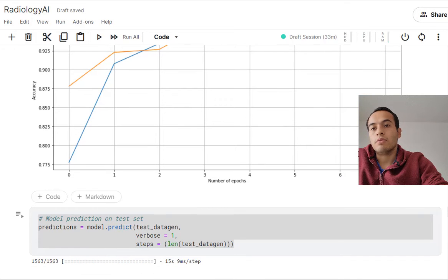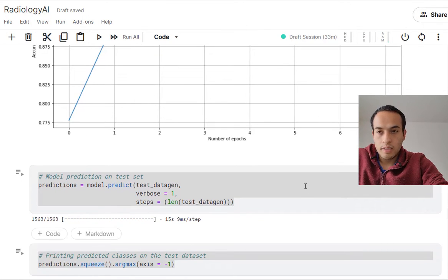So that told me to use another model and also use data augmentation to improve accuracy and loss of the validation.